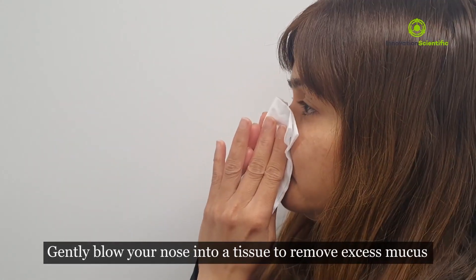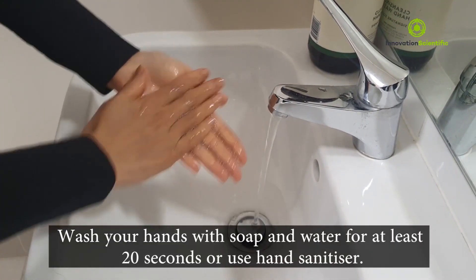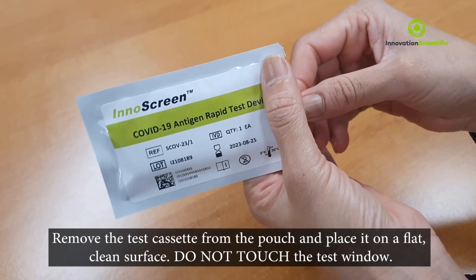Before you start the test procedure, gently blow your nose into a tissue to remove excess mucus. Wash your hands with soap and water for at least 20 seconds or use hand sanitiser.